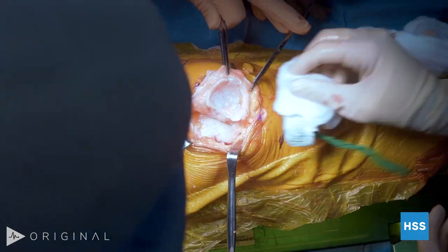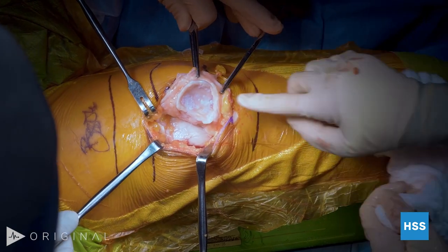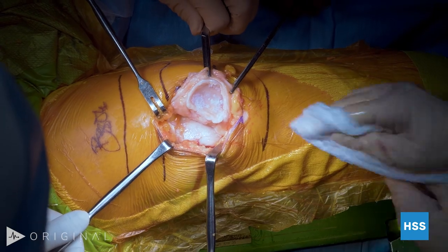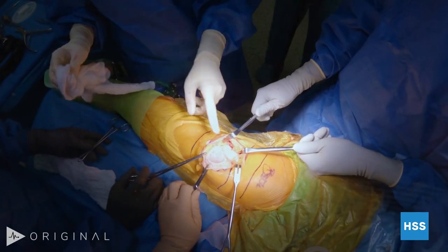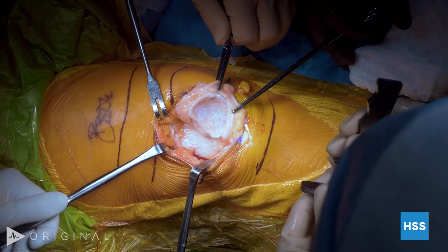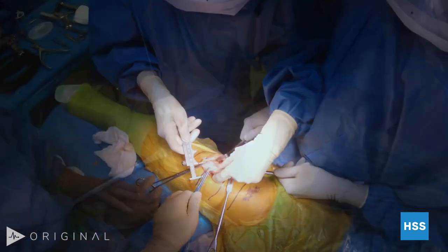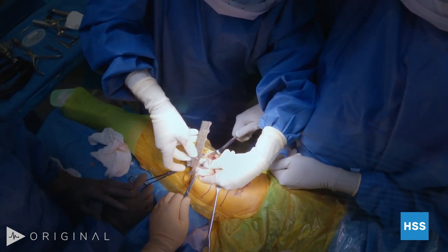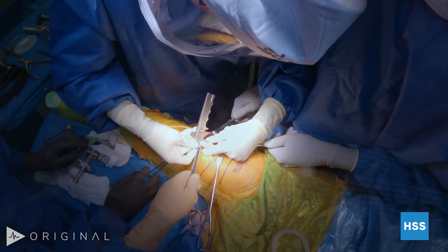This is an example of what I call an acetabularized patella. We talk about that in the shoulder when there's proximal humeral migration, but you can see it's now a cup — it's created a socket. When measuring, you have to be careful on that medial side — you really don't want to go much past 12 millimeters. I have had cases where I've had to go more; it's not ideal. This reads about 18, so we're going to try to get as far medial as we can.